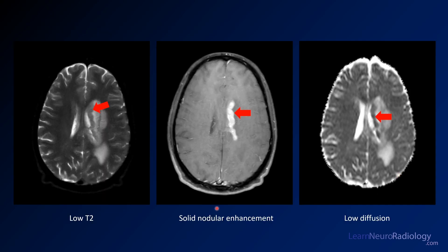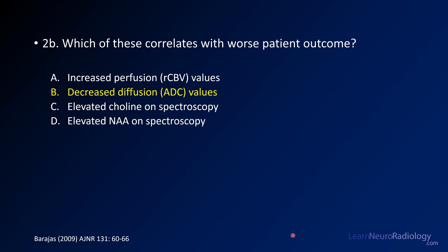Here are the same images we were looking at before. On T2 it's relatively dark. On post-contrast you see nodular enhancement along the margins of the ventricle, and on ADC it has low diffusion — see how dark it is. The answer to the second question is decreased diffusion values. It's been shown that the lower the diffusion value, the worse the survival, so that correlates with poor outcome.